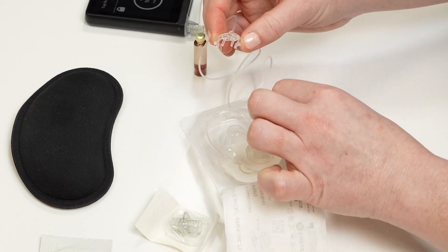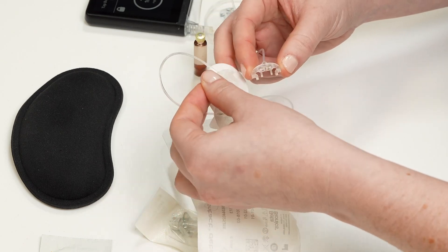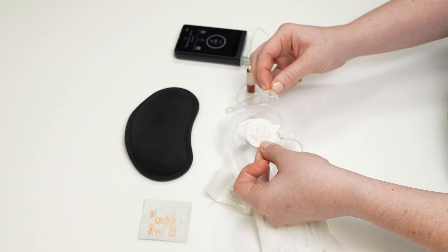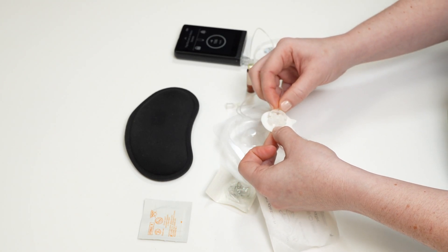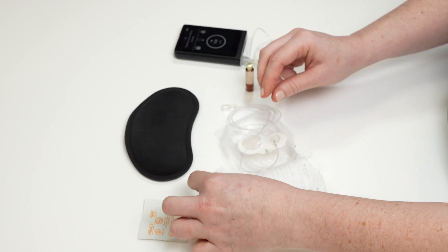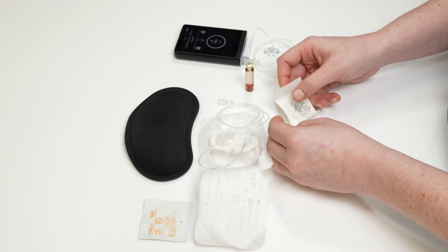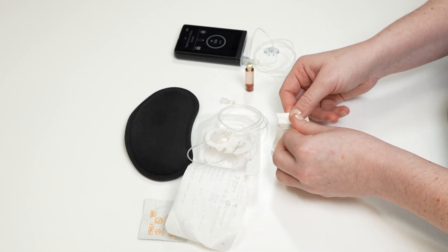To connect to the infusion set, gently push the end of the tubing into the plastic housing of the infusion set anchor. The tubing will only connect in one direction, so if it's not going in, flip the end of the tubing over and try again. Make sure to push the tubing straight into the anchor, not at an angle. You will hear it click when it is fully snapped in place. Now your two pieces of tubing are connected.